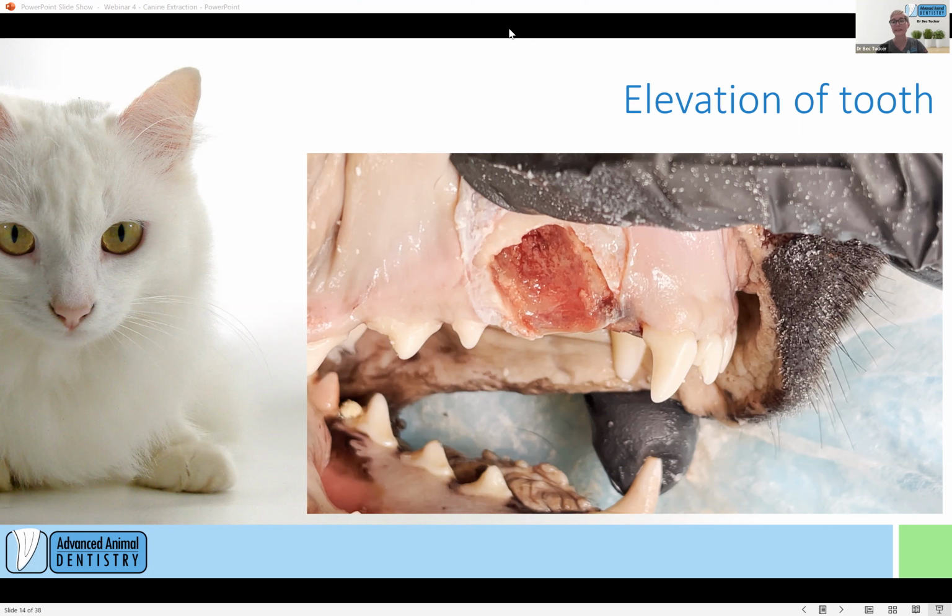So always attempt it. If it's truly ankylosed or resorbing and you leave some behind, and you don't have endodontic disease, so you don't have a fractured tooth with a tooth root abscess, and you're removing it above the level of any periodontal disease, then it's unlikely to cause a problem. But for us, we'll always attempt to remove it. In a maxillary canine, it's pretty rare that we'd leave anything behind. In fact, I'm a bit too stubborn about it, and we'll always spend far too much time trying to get even the tiniest tip or shell of the apex out. But yeah, I'd say always attempt it.